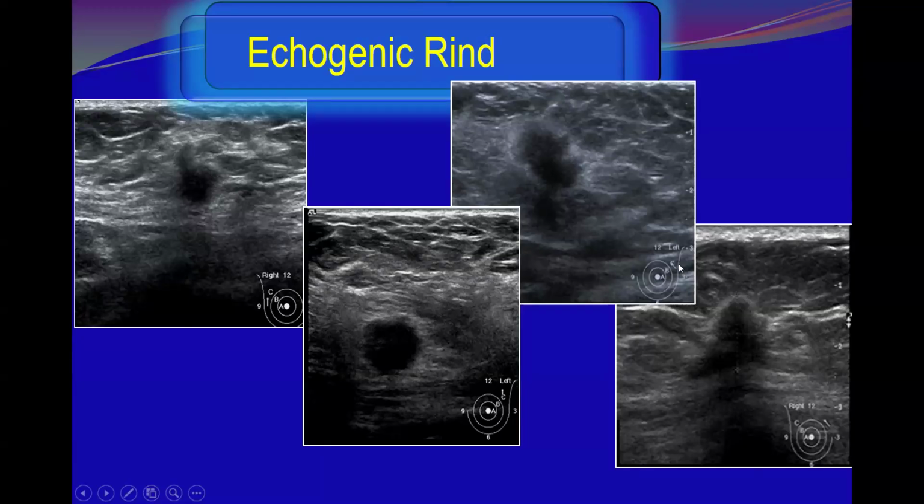Again, this is at the axillary tail, close to the axilla. And this is almost in the midline, near the midline. And I have shown you the previous example where the lesion was just in the subclavicular region. All these cases, what is the teaching point from these cases?